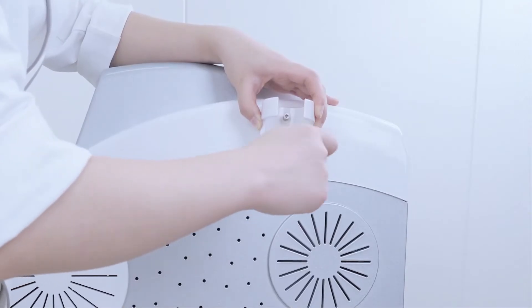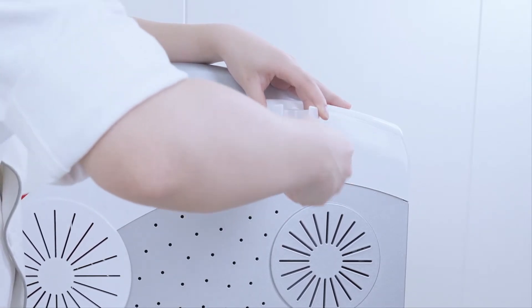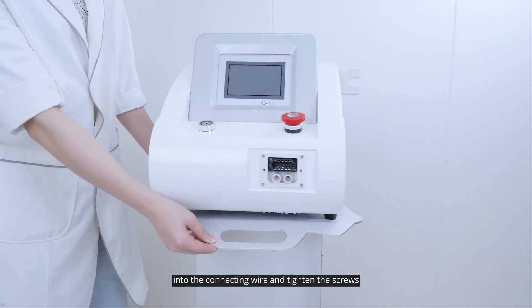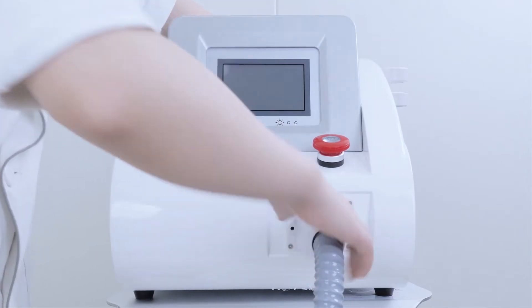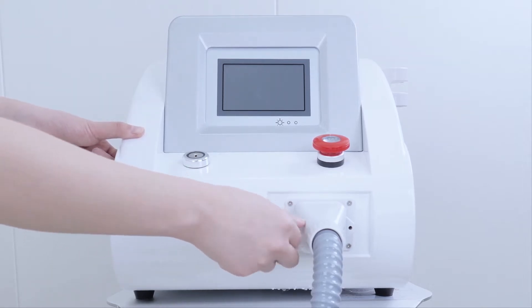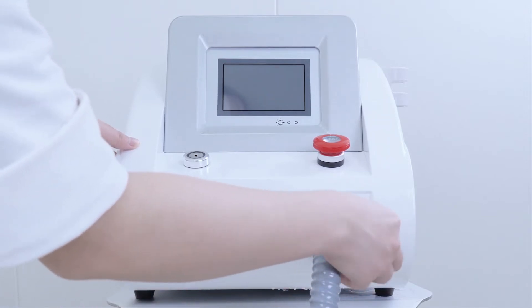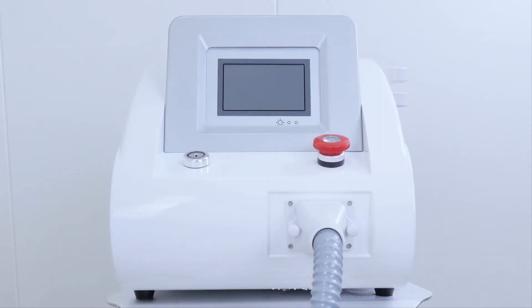Install the rack. Insert the hand piece into the connecting wire and tighten the screws, and link the connecting wire with the main unit. Put the hand piece in the rack.